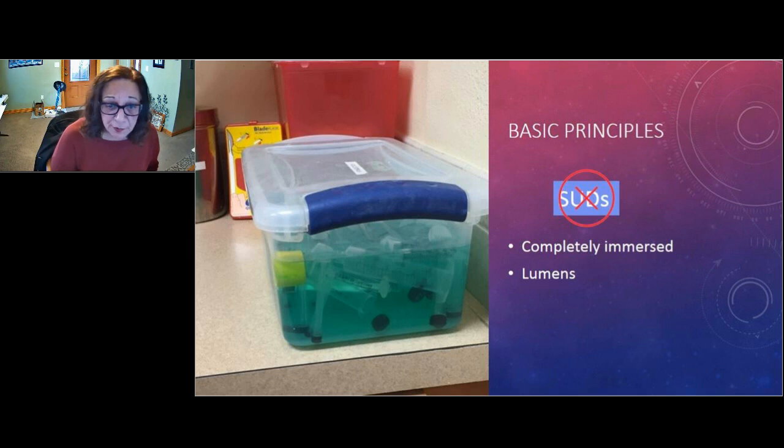So we're going to talk about some very basic principles. You need to start with a clean bin or basin, which you'll see here that fits that bill. It does have a lid. However, the problem with this bin is that it is something purchased from a retail store as opposed to created for medical purposes. Therefore, the question I would have for this practice is, how do you know how to clean it between uses? When you empty the chemical out at the end of its lifespan, how do you know how to clean that to make sure it doesn't have residual chemical and that it's safe to use to refill again?